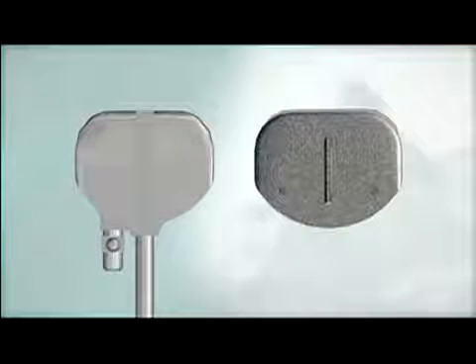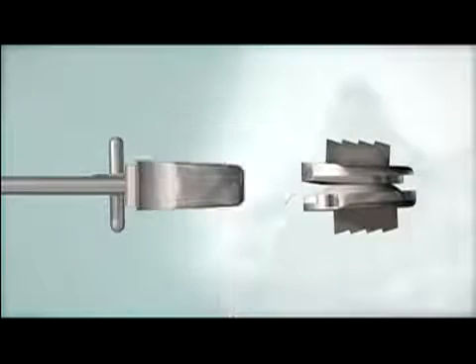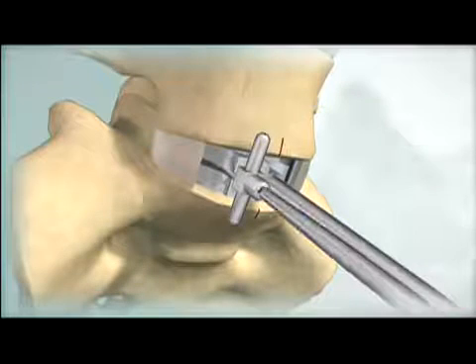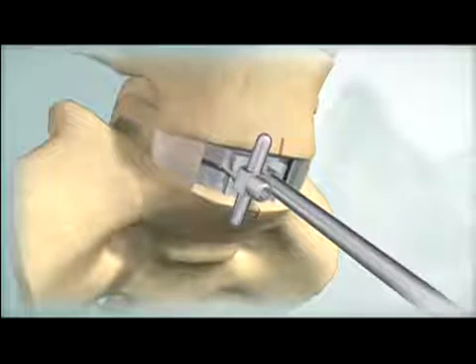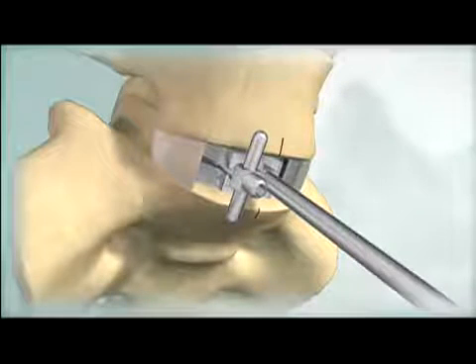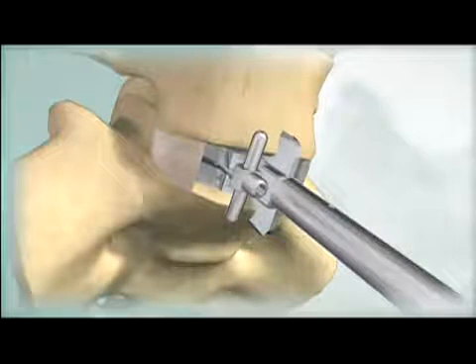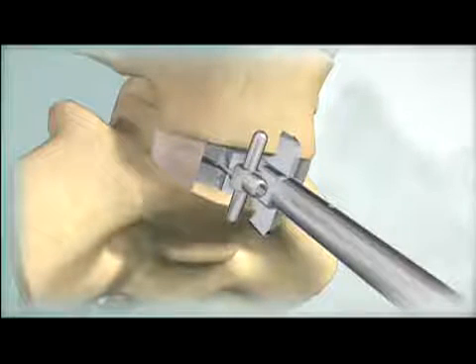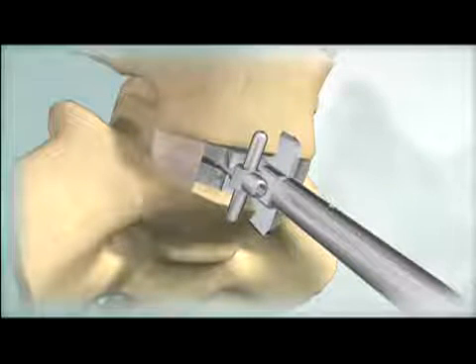Trial implants are used to determine the appropriate implant footprint, lordotic angle, and disc height. Advance the trial to the posterior margin of the vertebral bodies. The adjustable stop can be backed out to allow the trial to be positioned more posteriorly. Advance the chisel into the vertebral bodies until it is fully seated on the trial. The chisel and trial are left in place until the ProDisc-L implant is ready for insertion.